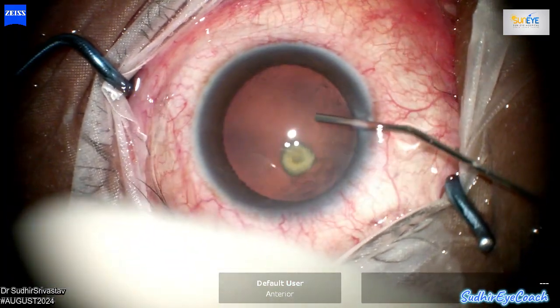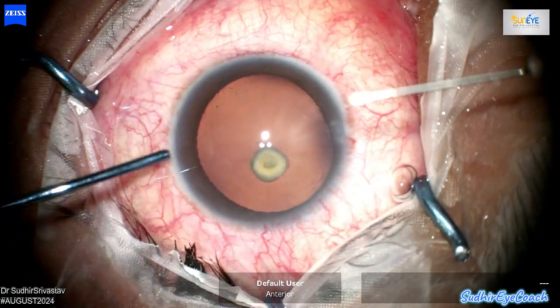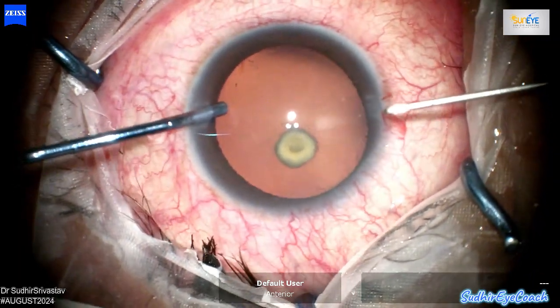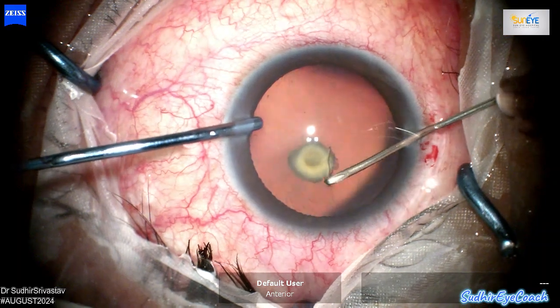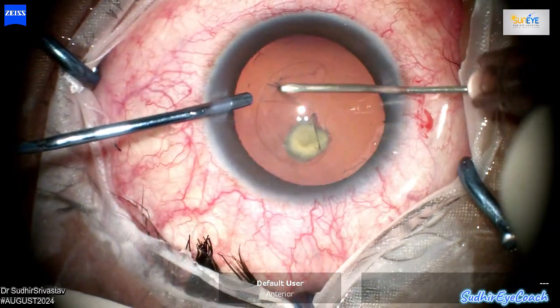Before surgery, if you carefully examine the patient on the slit lamp, you can often sense a defect in the posterior capsule. To confirm your suspicions, you can perform an anterior OCT or ultrasound, which provides detailed imaging to help assess the integrity of the posterior capsule.